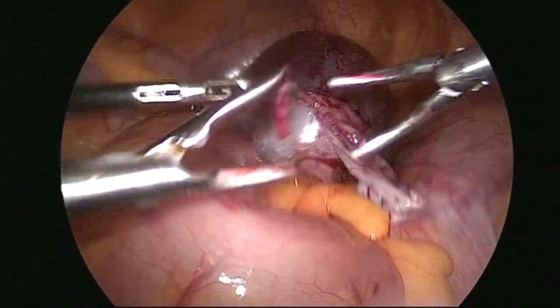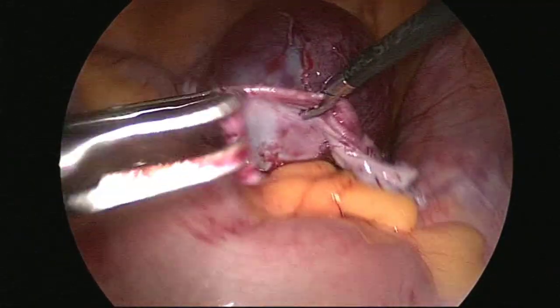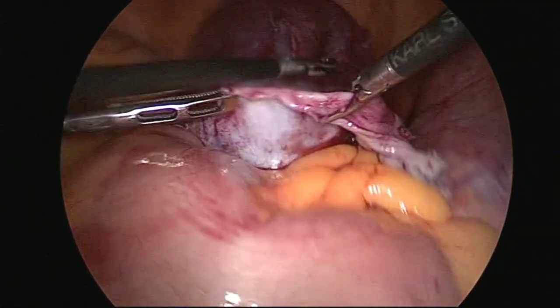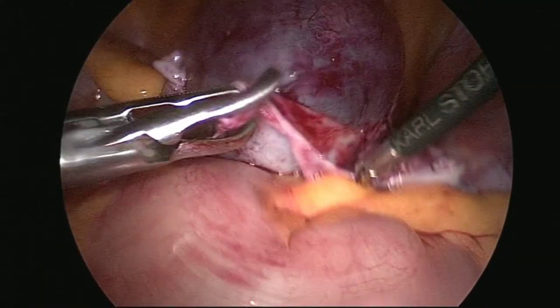I think almost the job is done. It will be separated by the gravity.